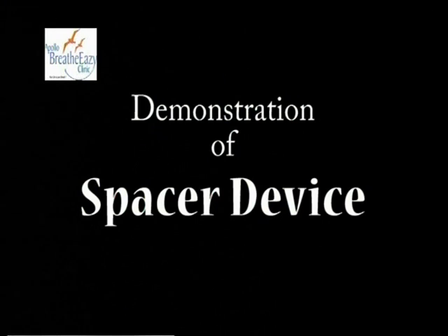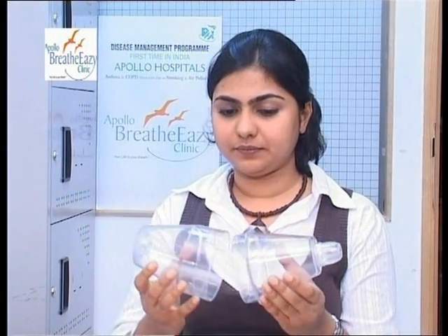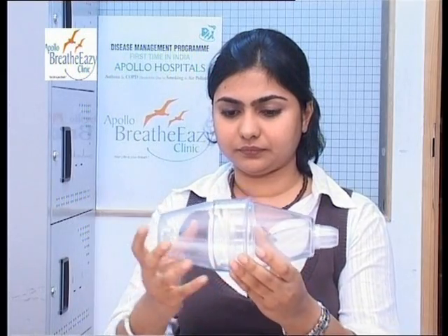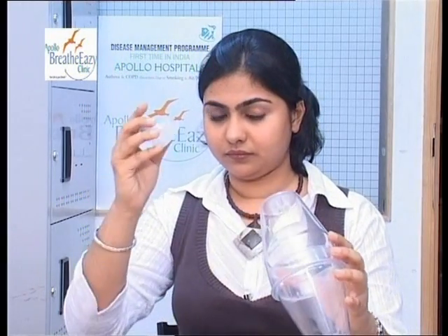This is a spacer device. Assemble the spacer device by bringing together both ends. Then attach the inhaler to the open end of the spacer device.